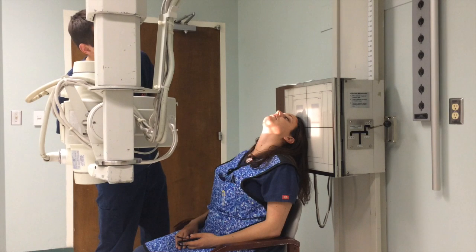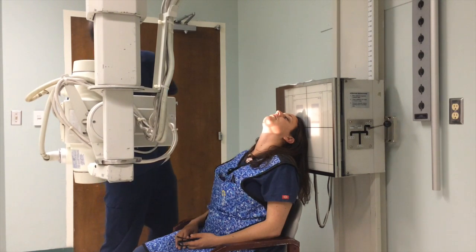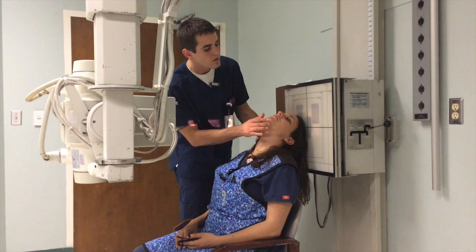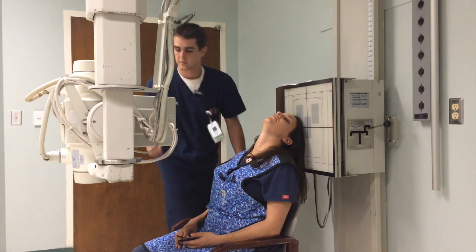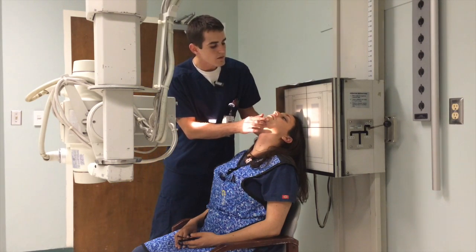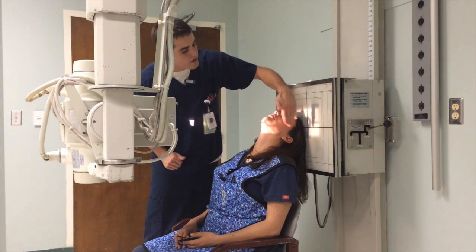We want to do still 1 inch posterior to the outer canthus. Just skimming the cheekbone.